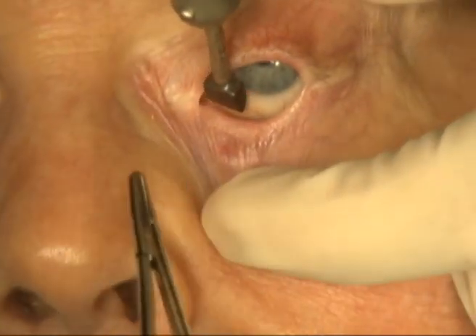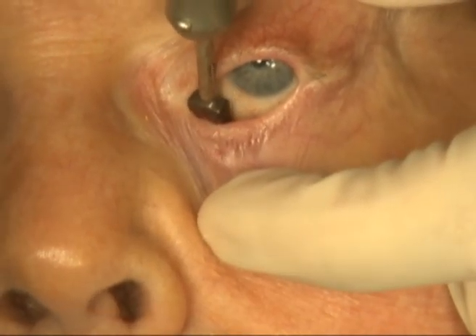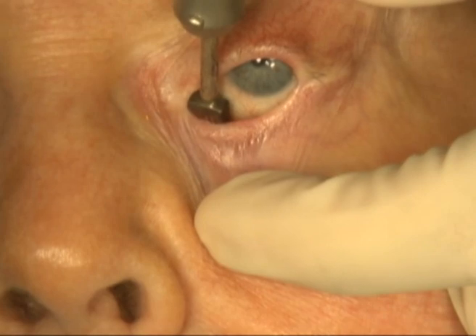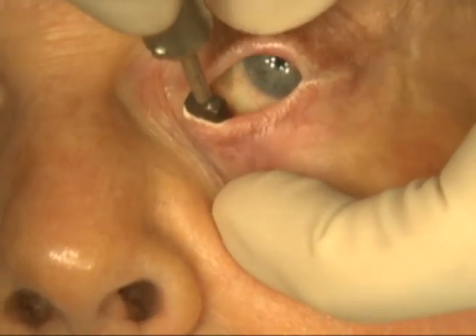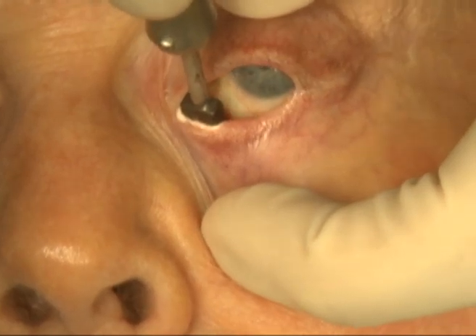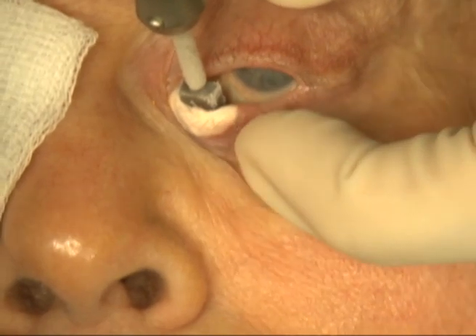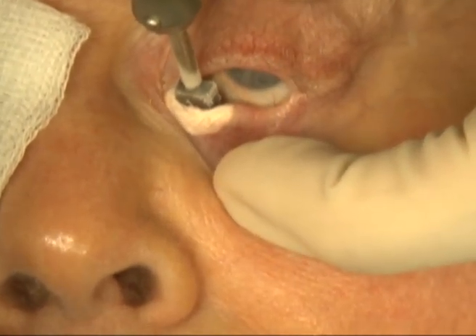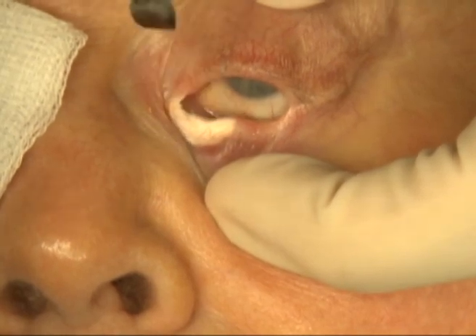You will notice on the second freezing cycle that the ice ball appears more quickly. Again, this is performed for 25 seconds and then the area is allowed to completely thaw. The probe will then be moved adjacent with a slight overlap and an additional freeze-thaw is performed.